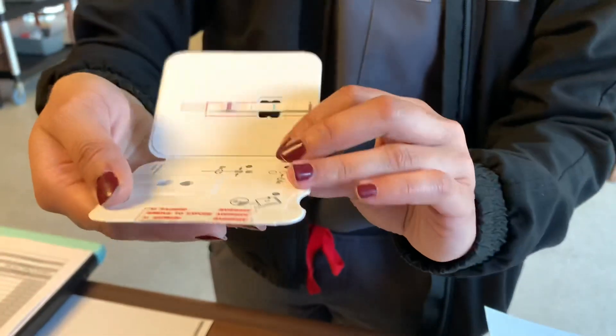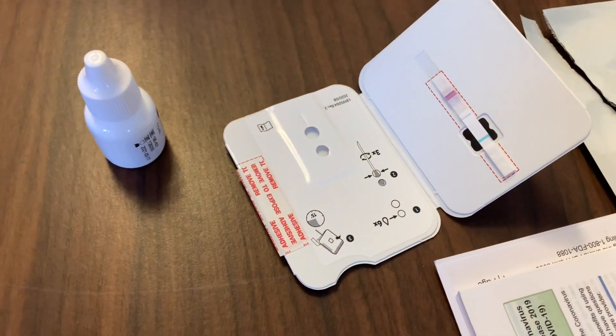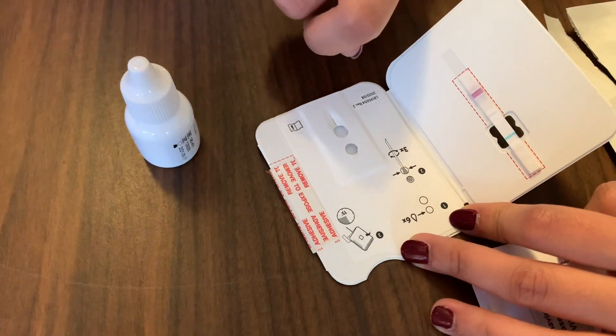So it always has to be flat for the 15 minutes. After you do the six drops, you would swab yourself — the same as always, five seconds on each side. Then, as shown in the diagram, you'd push it through the lower circle and rotate it three times.